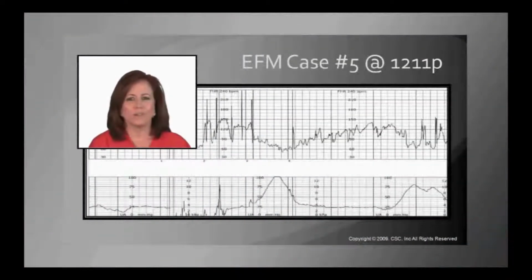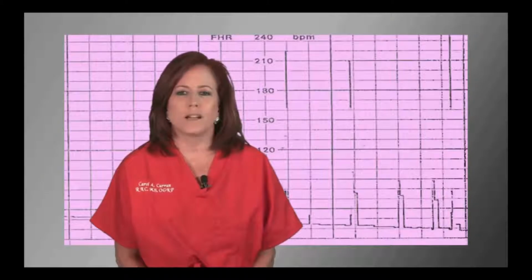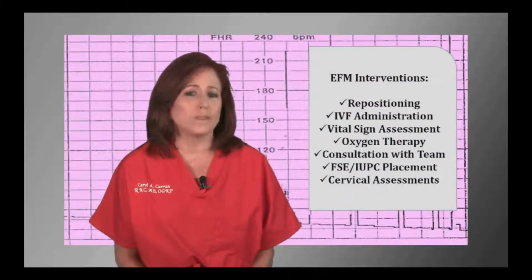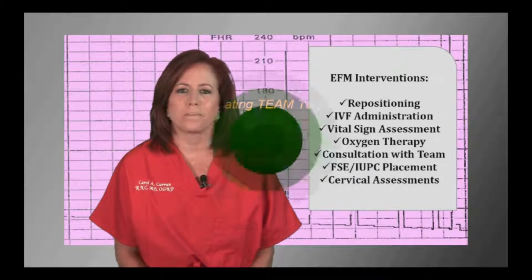Are there any other maneuvers to perform which may improve this tracing? The team has utilized a number of interventions listed here. Overall, the team has done well. As outlined in Lesson 5, oxygen therapy should be a short-term second-line therapy.